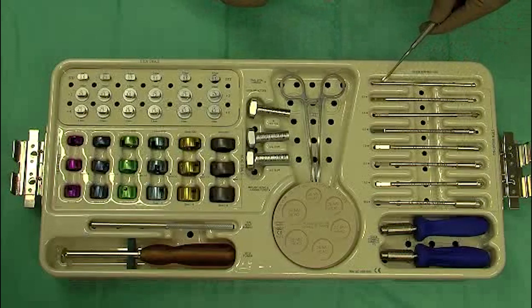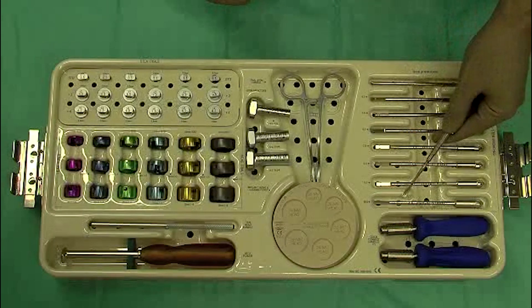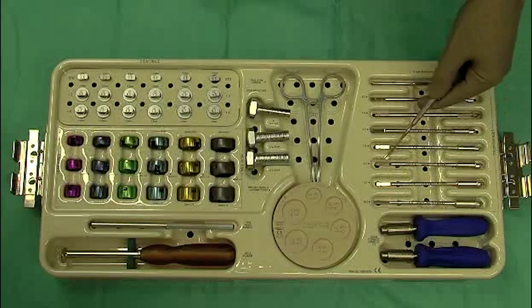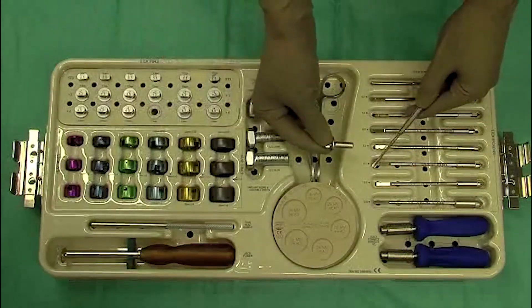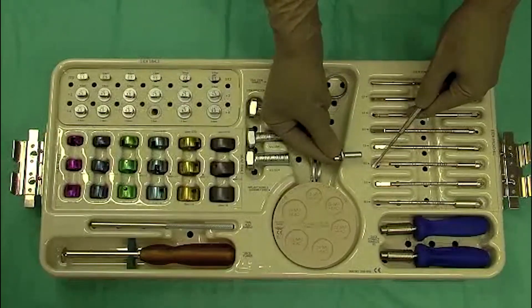We have a starter awl, and awls ranging from 4.5 to 10.5 millimeters in diameter. This is important because typically if we rasp to an 8.5 millimeter, we'll use a 7.5 millimeter stem — typically downsizing 1 millimeter over the size of the stem that we're using.